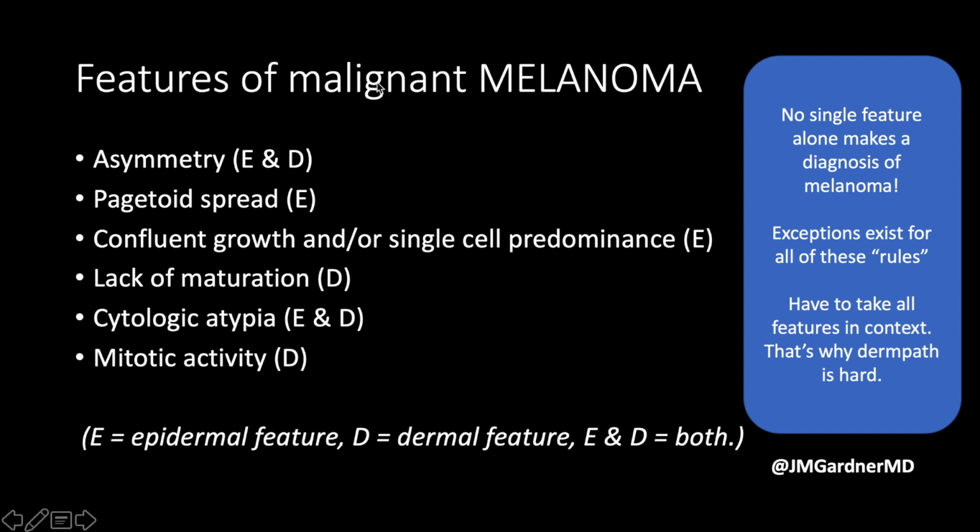But of course, you have to take it all into the context of the clinical, the age of the patient, the site, all that stuff, which is why dermpath is hard. And some days, even for me, I'm like, man, I thought I was going to get better at this one day, but it's still so hard and I still struggle. So thankfully, I'm surrounded by really smart colleagues to help me out. Now, let me show you examples of all this.